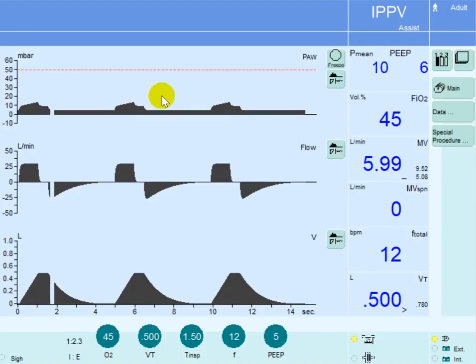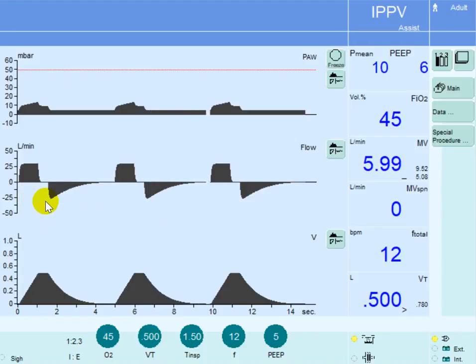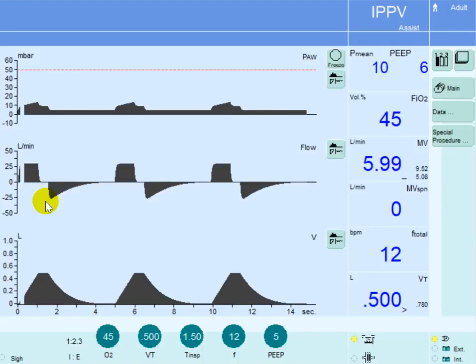This breath is a mandatory breath. You can see the patient is not initiating any efforts — this patient is breathing in a controlled mode of ventilation, and the control here is volume.